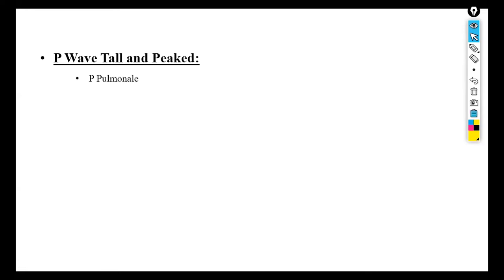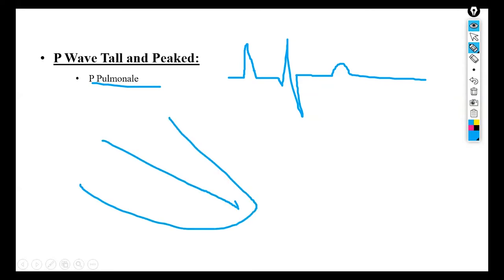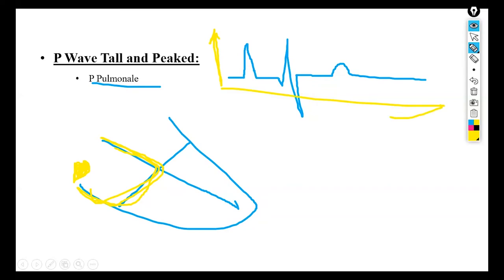The next disease is P wave tall and peaked. This is similar to P mitrale, but instead it is called P pulmonale, defined as hypertrophy of the right atrium. The sinoatrial fibers are stretched and enlarged. There is more current generated; when more current is generated the voltage increases on the graph, so the P wave increases in its amplitude, appearing tall and peaked.